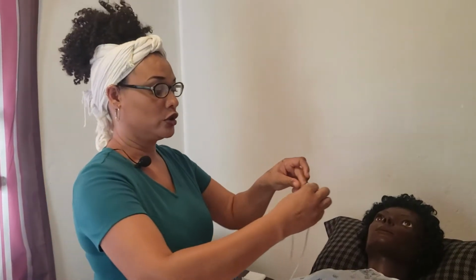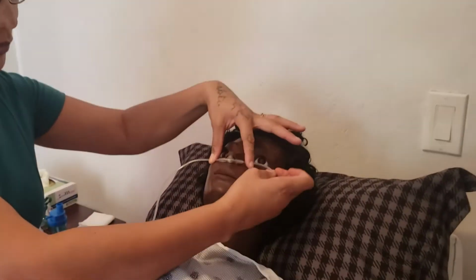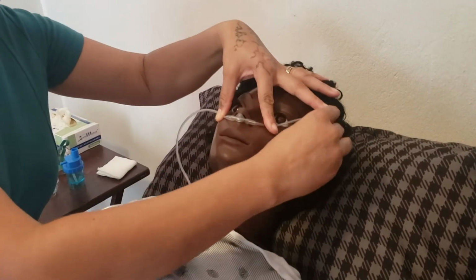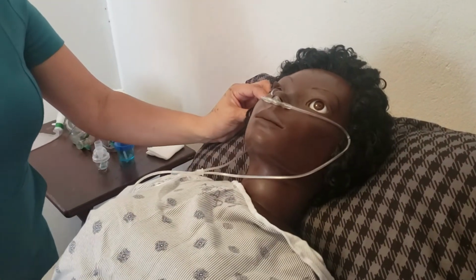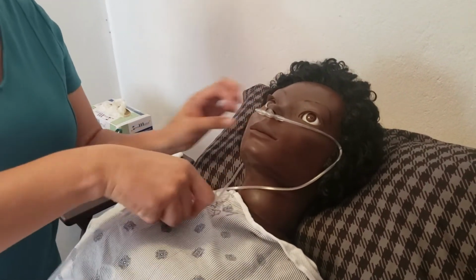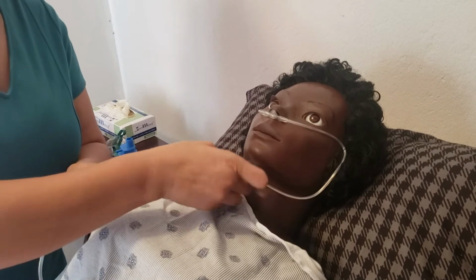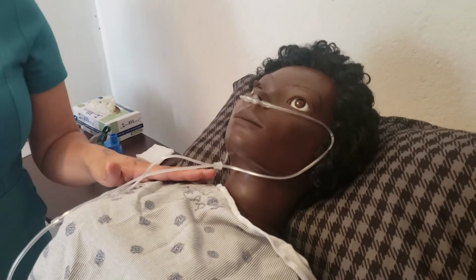So you would set up your patient by turning the cannula in the correct direction with that little tab facing up. And then you are going to hook it over the patient's ear. Then adjusting the lock below the chin. This helps to keep the cannula in place.